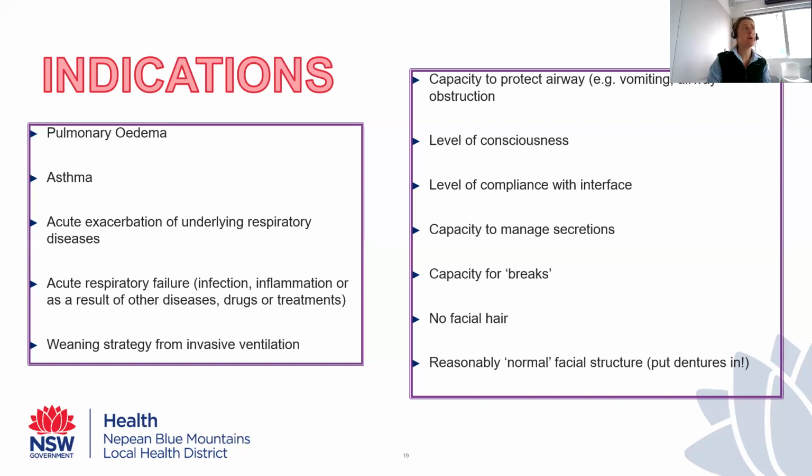Capacity for breaks, and this is probably one of my biggest bugbears around non-invasive ventilation. It is not okay to put someone on CPAP or BiPAP via an oronasal mask and just leave them for hours and hours and hours or days and days without a break. So patients need to be able to come off to eat and drink. And even if we're giving nasogastric feeds and IV fluids, they need a break for pressure injury relief.